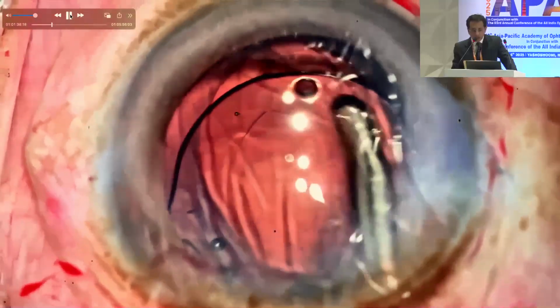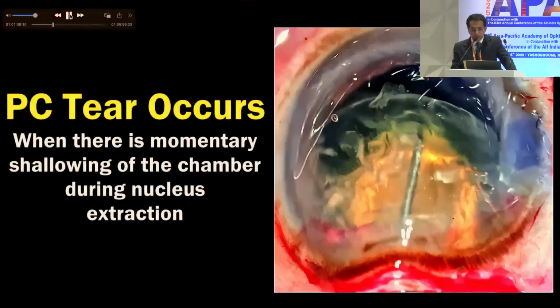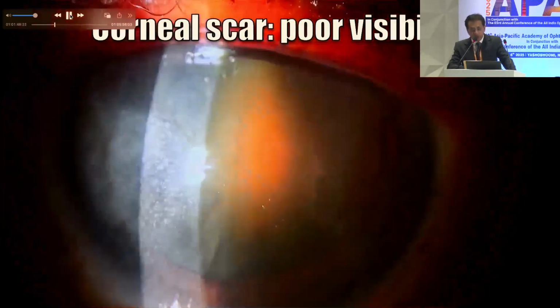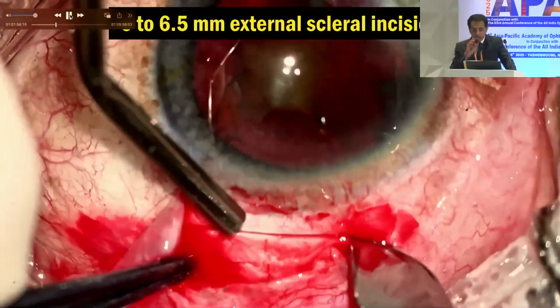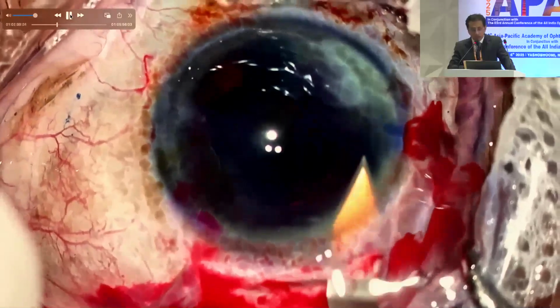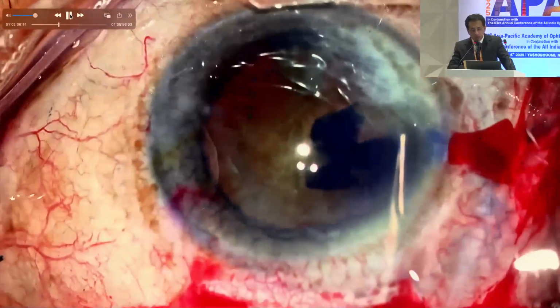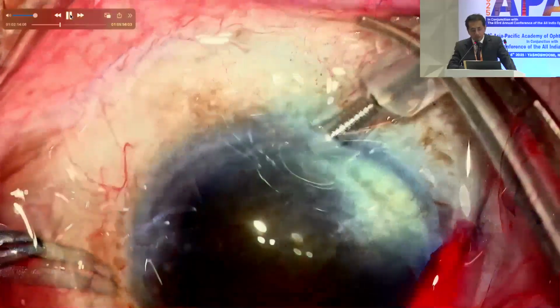So my question was, can we prevent this posterior capsular tear in PPC cataracts, since that momentary shallowing was the step at which it actually happened? How can we prevent this? This is another dense cataract with a posterior polar cataract, and there's a reason why I chose to do a manual SICS over phacoemulsification. We performed the same steps, with a large oval rhexis, but one additional thing I did in this case was, during delivery of the nucleus, I didn't want the chamber to shallow. At that stage, I thought it's better to maintain the chamber using an AC maintainer.